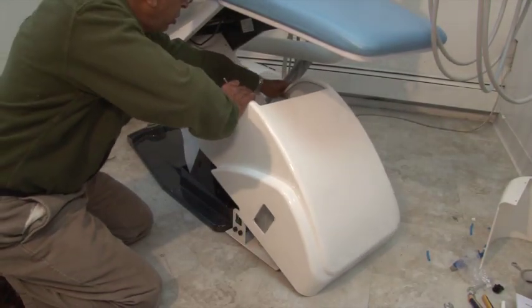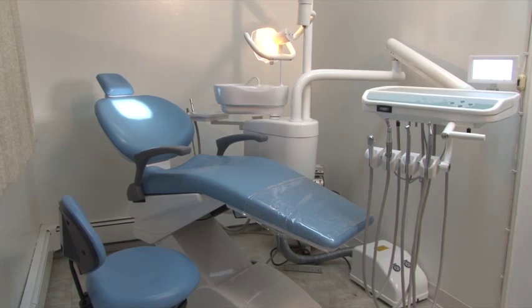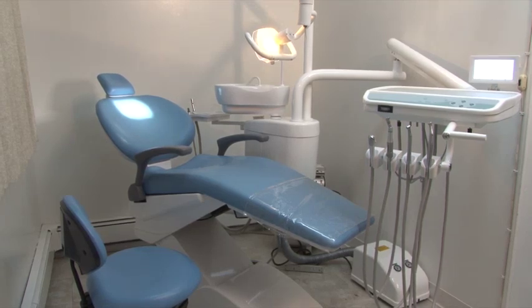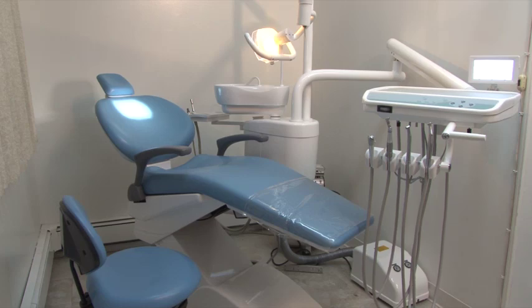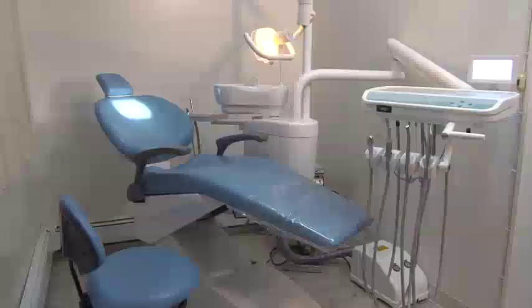Finally, place the white plastic base cover and tighten the two screws on both sides. Once again, we thank you for purchasing the dependable dental chair. For any sales questions or additional information, please call 800-733-7490. If you need any additional technical support, please call 215-390-3865.